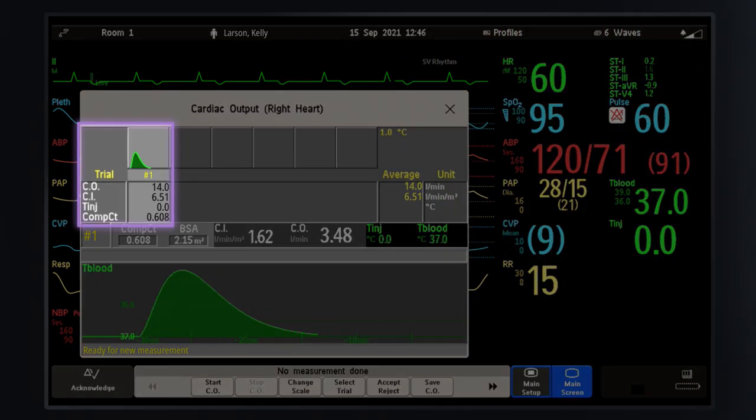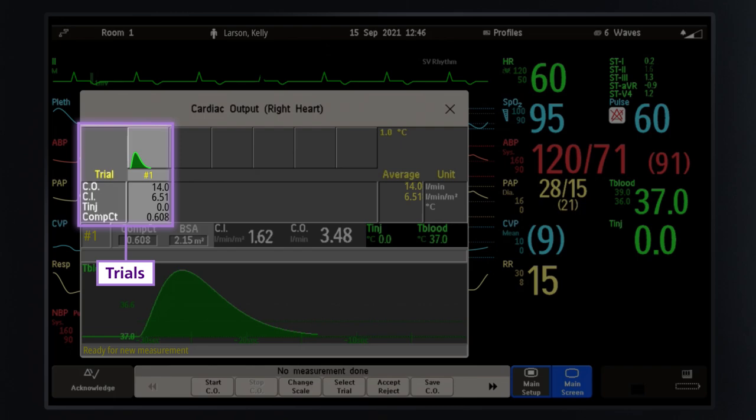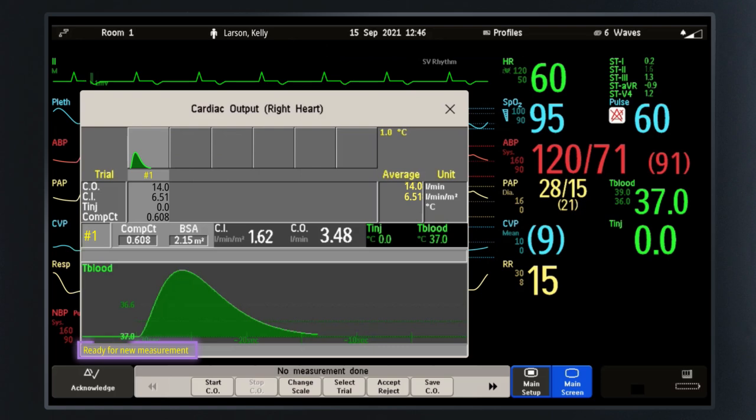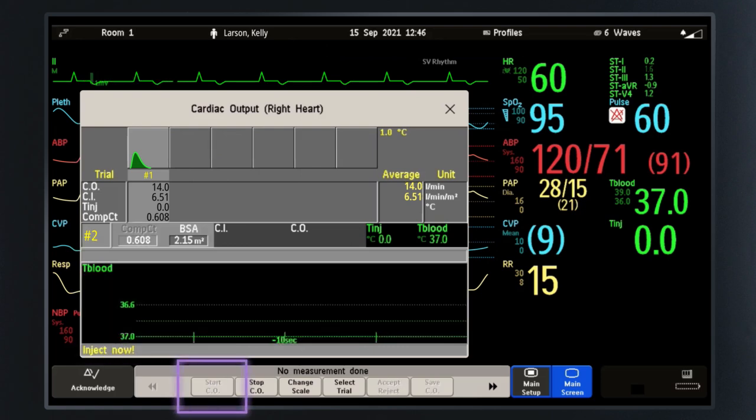Once the measurement is completed, the thermo dilution curve and measurement values are displayed at the top of the window. The CO measurements are referred to as trials in the monitor. At the end of the measurement, the monitor prompts 'Ready for new measurement.'